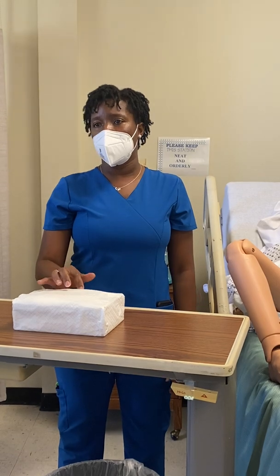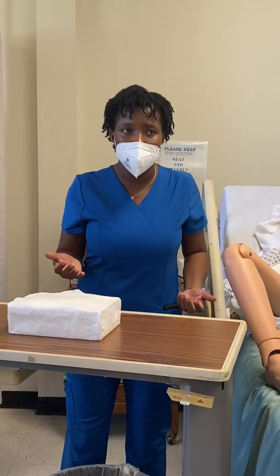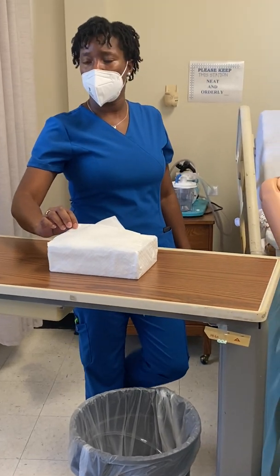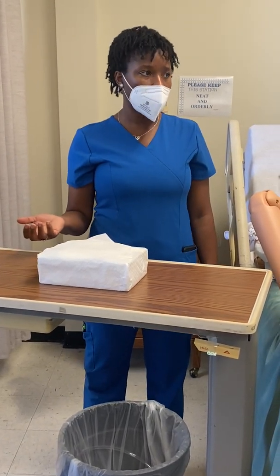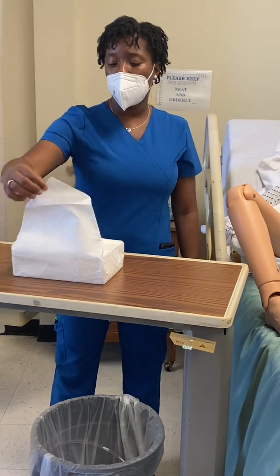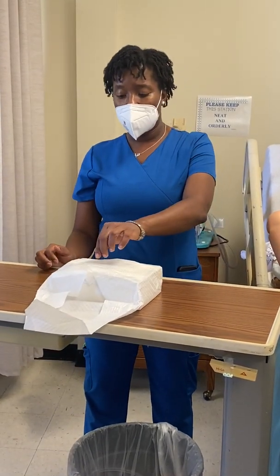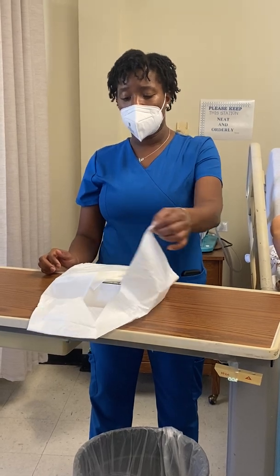Because sometimes it's not. It gets tucked away some kind of way in packaging. But remember, you can always just pull up. Okay? So if you need to do that, that's okay. So you're going to pull it away from you first. Now, you're just going to take the other side. Remember, none of this is sterile at this point.